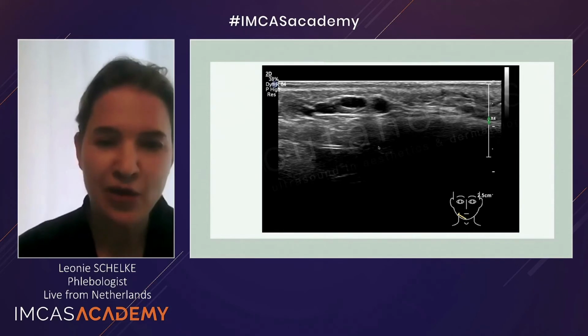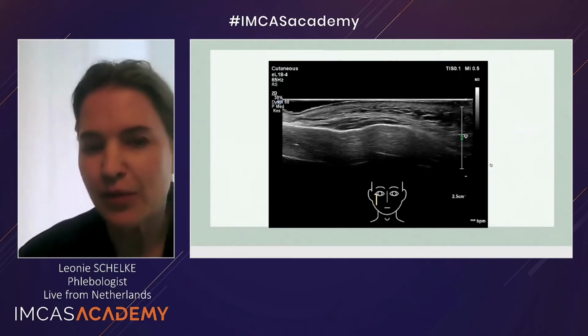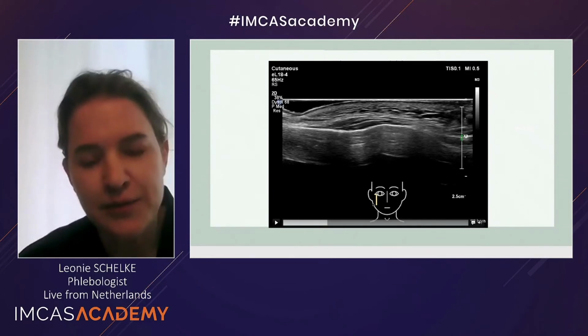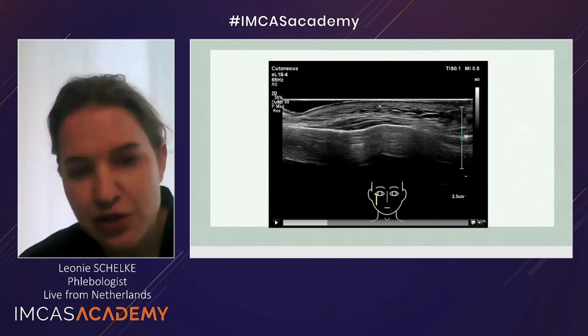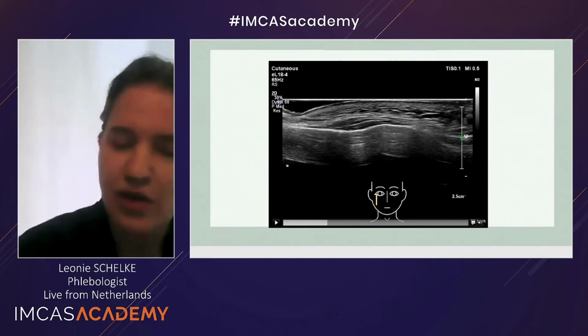And if you look at mobility, so let me tell you where we are. We're here at the orbital rim. So this is the orbital rim. This is your orbicularis oculi muscle, the SOOF, deep fat pad, the pre-zygomatic space, and this is your superficial layer where you just saw the product injected. Now, the orbicularis oculi muscle is the floor of the superficial fat pads.